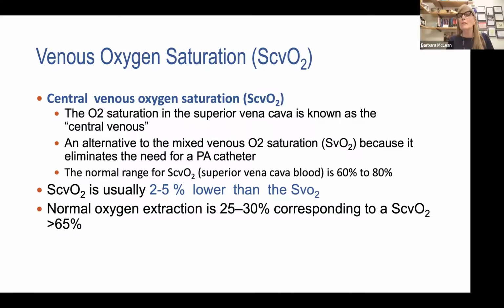In either case, I think one is better than the other. Personally, I always want to be continuous. When my grandbaby walks for the first time, a still photo, 1 second in the time of him walking, is not nearly as meaningful as a video. And that's exactly the same when we talk about ScvO2. Now that requires that you have a central line in the superior vena cava, and we're actually monitoring it continuously with a specialized central catheter or intermittently with a central catheter.